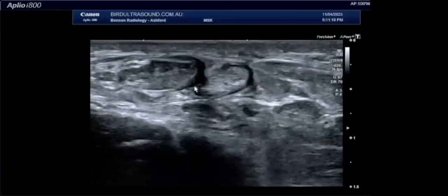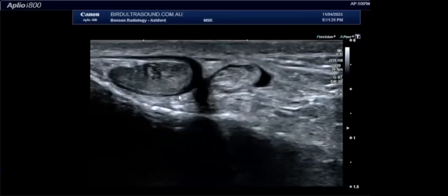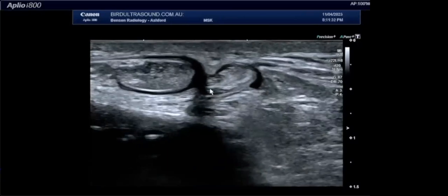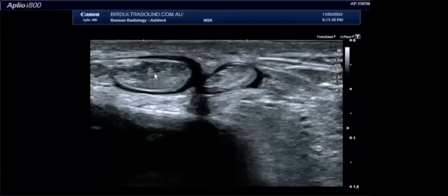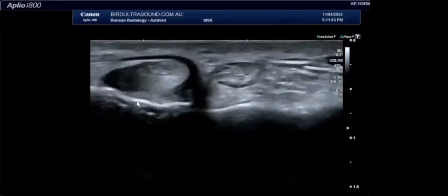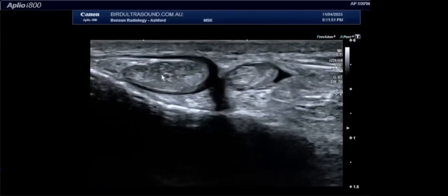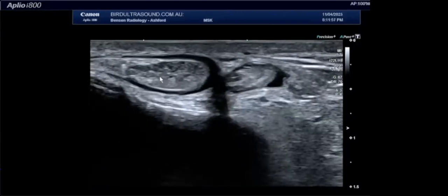And these are the two straps of the inferior peroneal retinaculum. As these come into view, you know you're about to see the peroneal tubercle, and this is in fact the peroneal tubercle here. So when peroneal tendons get into trouble, it really comes in two types. Peroneus brevis gets into trouble at the lateral malleolus through a compressive effect from peroneus longus, and peroneus longus gets into trouble right at this level here, at the level of the inferior peroneal retinaculum and the peroneal tubercle, and this is a stenosing tenosynovitis, very similar to what abductor pollicis longus and extensor pollicis brevis suffer in extensor compartment 1 of the wrist. It really is de Quervain's disease of the lateral ankle.